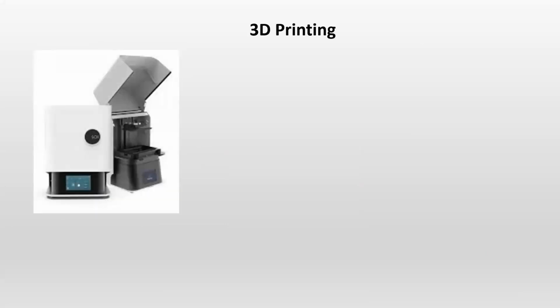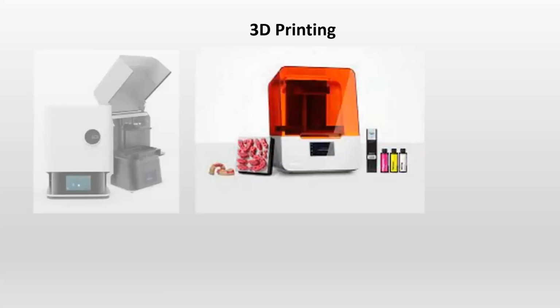Moving on to 3D printing, basically the 3D printers available today are small desktop 3D printers, which can be used in office. And these can be used for various applications like crowns and bridges, printing the splints, temporary crowns. We also have permanent resin nowadays, which is available, and we can print the permanent crowns. And different printers are available with a different price range, and they come with their own resins as well. Different resins are available for different workflows.